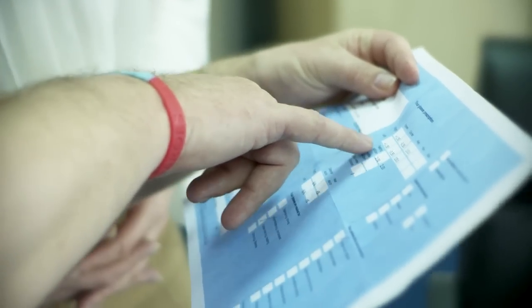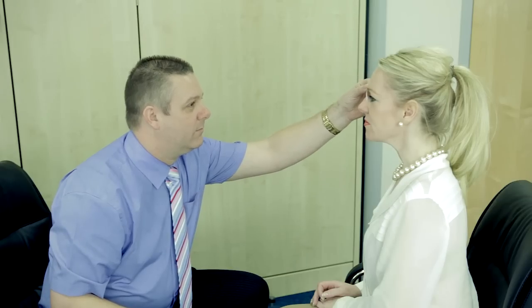You should ask your optician for the PD measurement. However, the optician testing your eyes is under no obligation to provide it or there may be a small fee. Thankfully, you can measure your PD yourself with the help of a friend or family member.